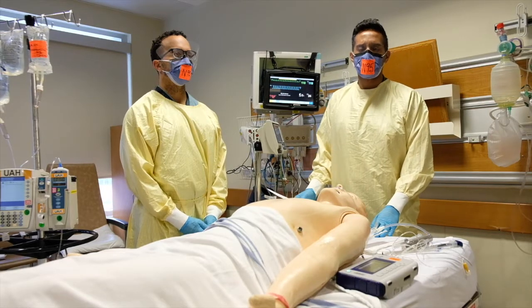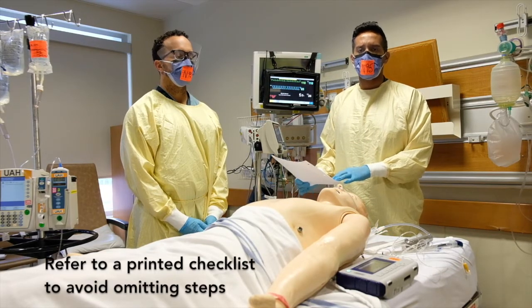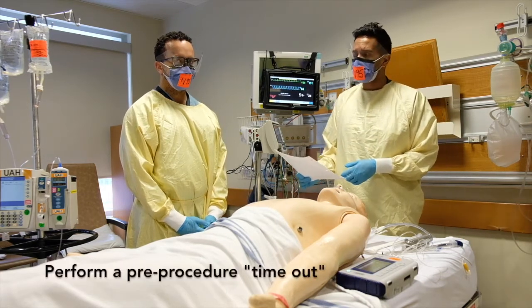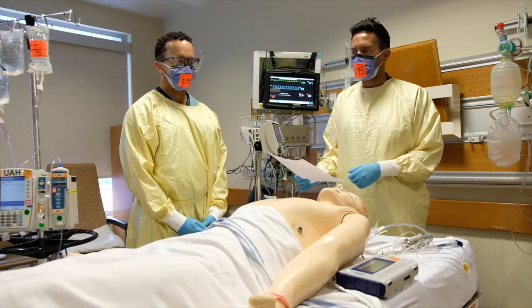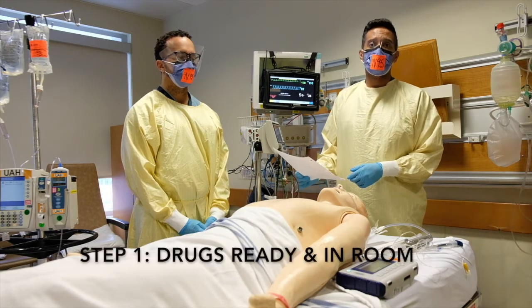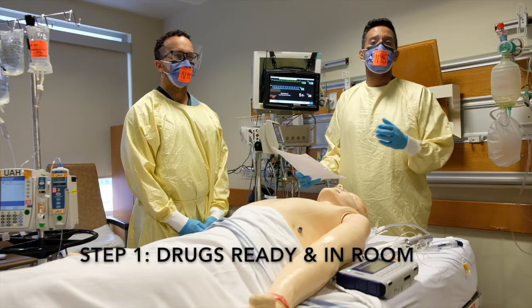So for the first step in intubating a COVID-positive patient, we suggest going through your own unit's intubation checklist, which serves as a timeout just prior to intubating. So we're going to be intubating this patient that likely has COVID-19. I'm going to go over first the drugs that we need to have in the room, and they should already be in the room so that we minimize the number of times that people go into and out of the room.